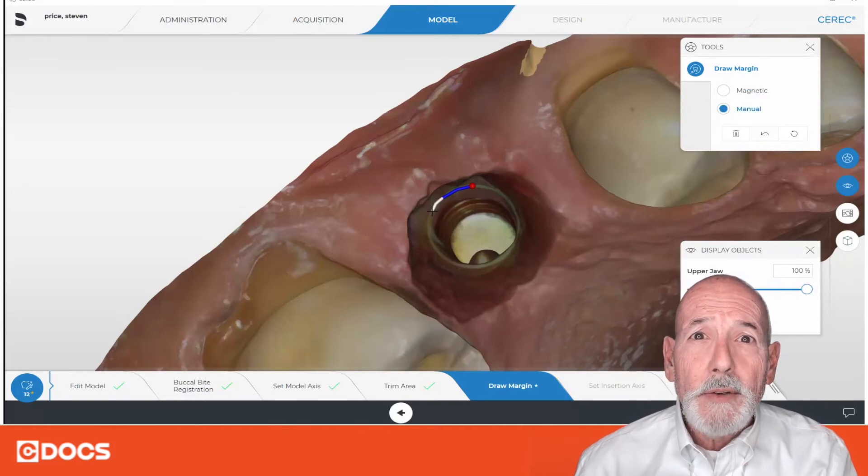So I'm going to go ahead and start drawing. I started with the magnetic or automatic mode right off the bat, and then I went ahead and switched to manual mode to make it a little bit easier to go ahead and draw the margin.